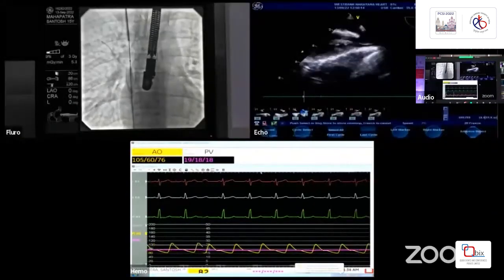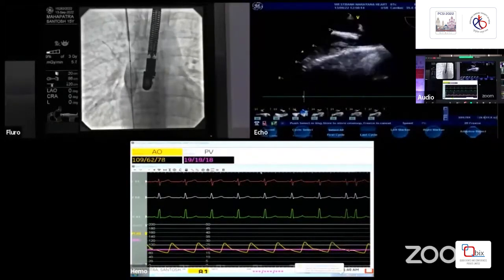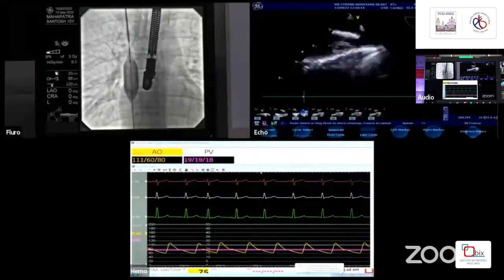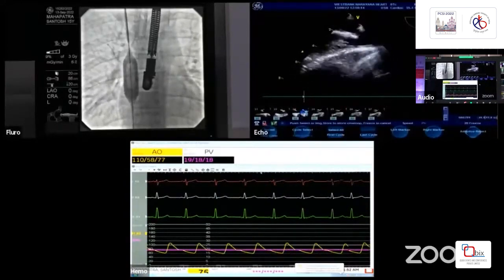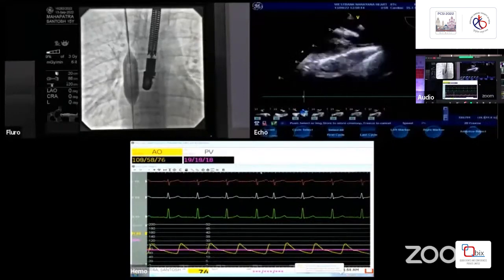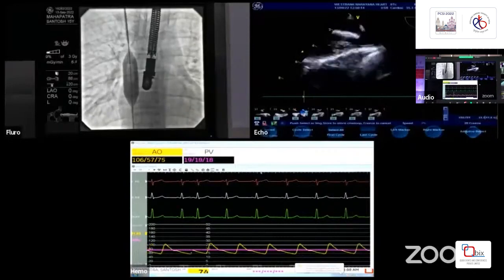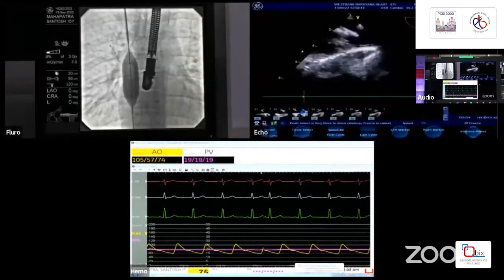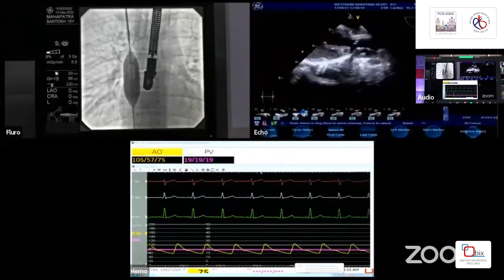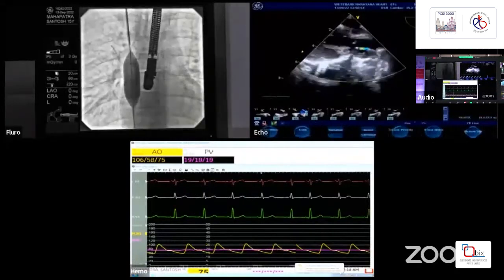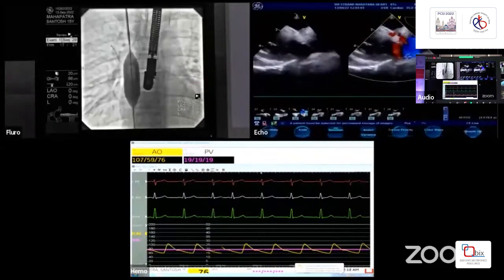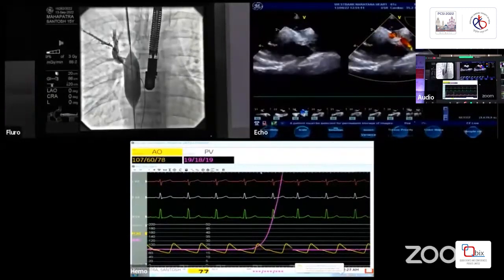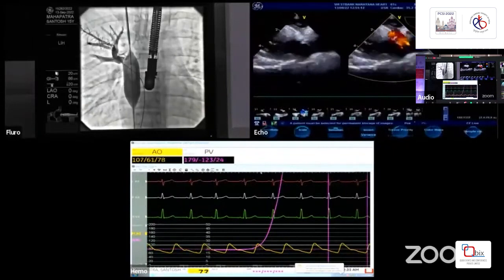We have established a veno-venous loop from the right femoral vein to the right internal jugular vein. We are inflating a Z-Med balloon — 22 mm by 40 mm, 40 cm length — up to 4 atmospheres to occlude the sinus venosus ASD. The balloon is fully inflated and the sinus venosus ASD is completely closed on transesophageal echo. However, the right upper pulmonary venous flow appears interrupted — obstructed. We are injecting contrast into the right upper pulmonary vein and there is holding of dye.